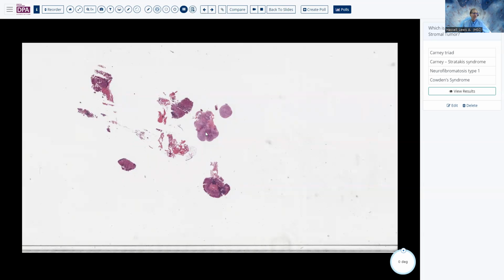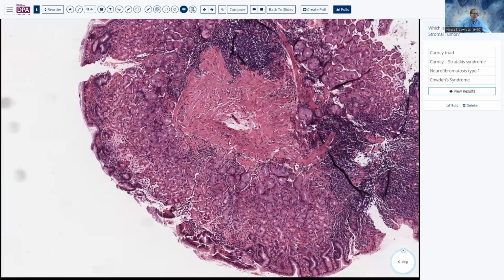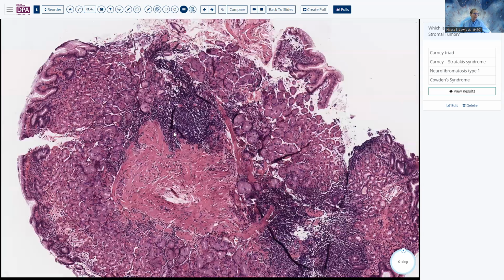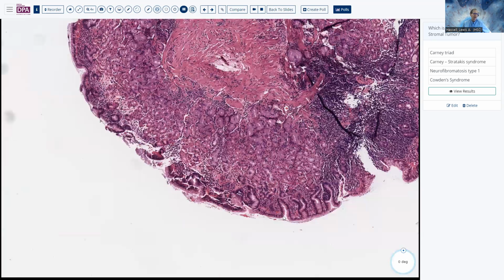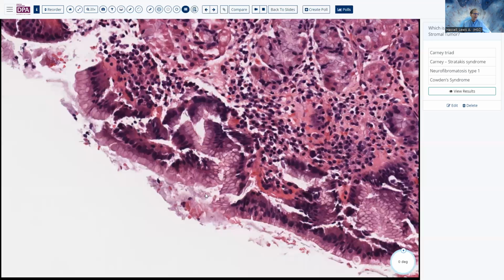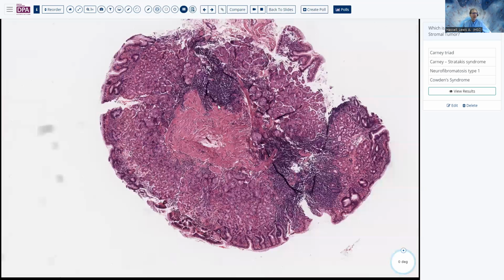All right, so coming back to the tubular tract here, we'll look at this stomach biopsy for a submucosal nodule. We see a little bit of lymphoid aggregates. Lymphoid aggregates are not a very specific finding. They don't really indicate gastritis, although they may sometimes be seen in the setting of prior Helicobacter infection, maybe a sort of resolving situation. So I would look around to see if I saw any evidence of Helicobacter in this sitting, and I might even stain it if I had very much that was superficial. But just on the basis of a lymphoid aggregate alone, I would not do it.